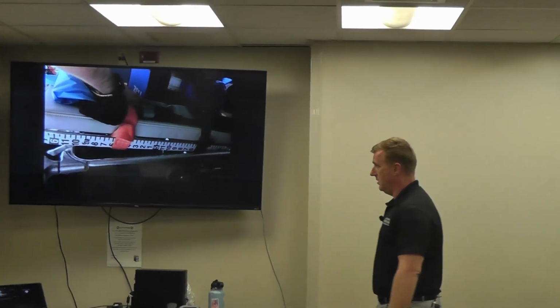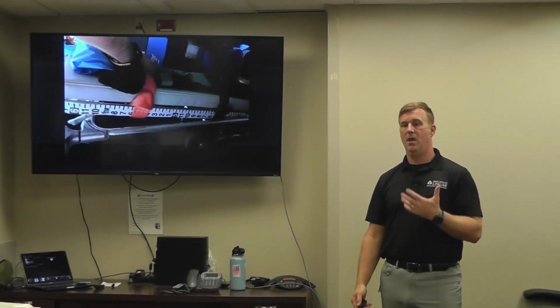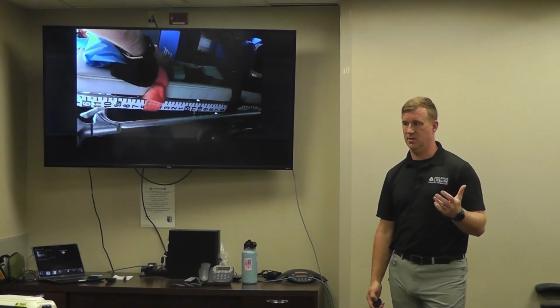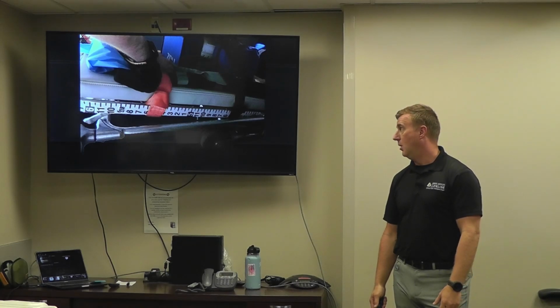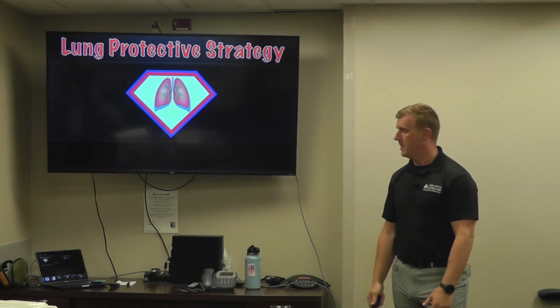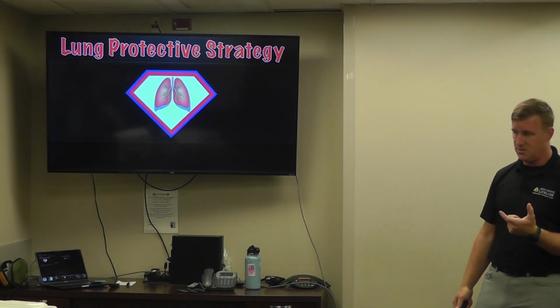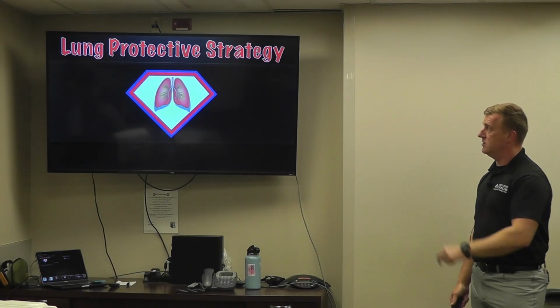Height is super important, and for all of us that are doing interfacility transport, the vast majority of the time, somebody's gotten a height on that patient, and you usually can get that information from the sending facility, right? If it's Epic, it's right there on the left, or you can ask, and it's going to be in a chart somewhere. Okay, so you're going to figure out height, and you're going to figure out what's wrong with your patient. That's our starting point. So we need those two pieces of information to then figure out what we're going to do.